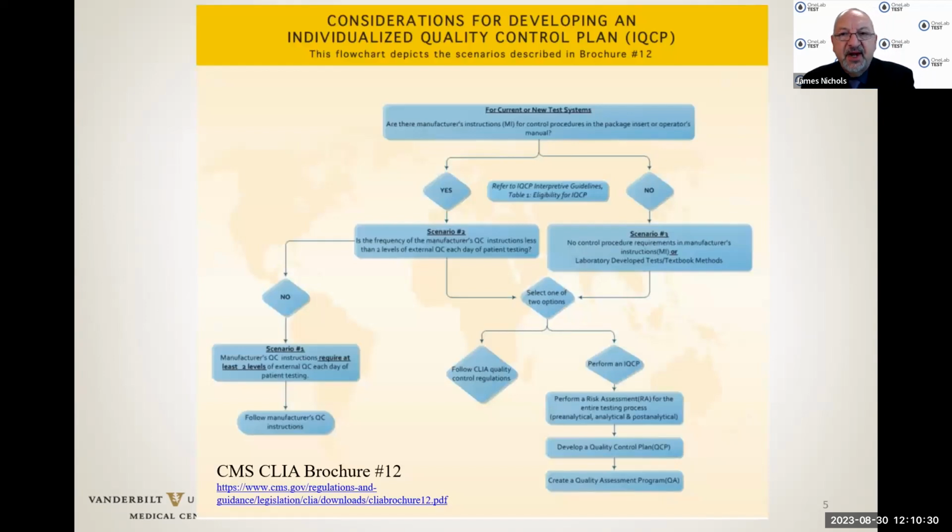Now, some considerations for developing an individualized quality control plan. And I took this out of CMS CLIA brochure number 12. You can see at the bottom of this slide. So starting at the top, for current or any new test system implemented in the laboratory, are there manufacturer's instructions for control procedures in the package insert or the operator's manual?